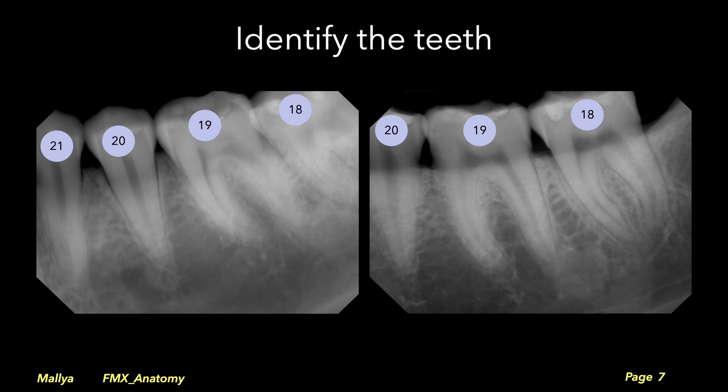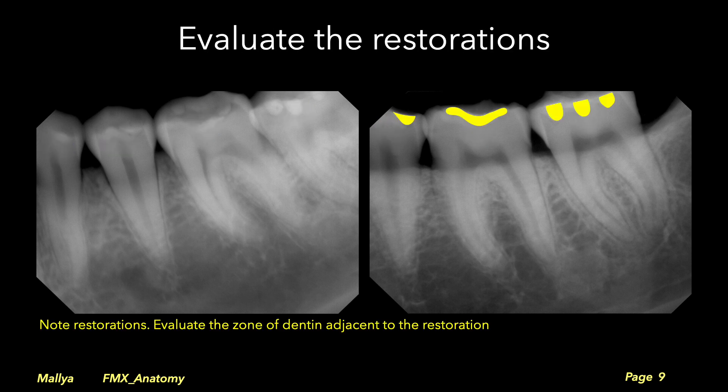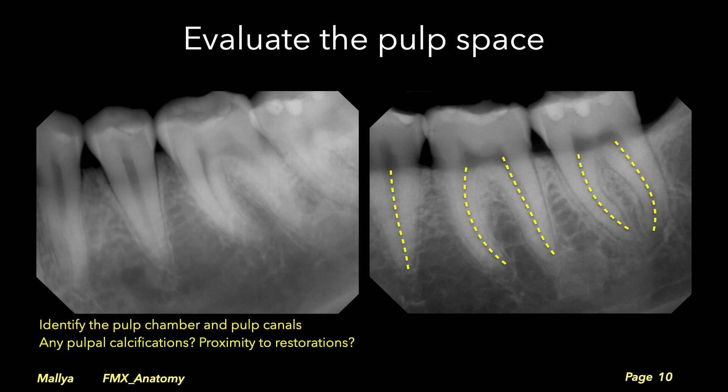We start by identifying the teeth, evaluating the morphology of the crowns, evaluating restorations, and examining the zone of dentin adjacent to the restorations. Next, identify the pulp space and trace the pulp canals from the pulp chambers to the apical foramen. Assess for calcifications in the pulp and any localized areas of dilation that may suggest resorption.